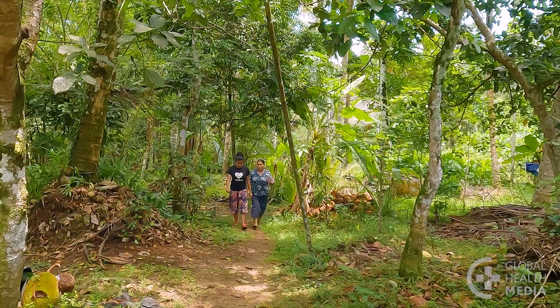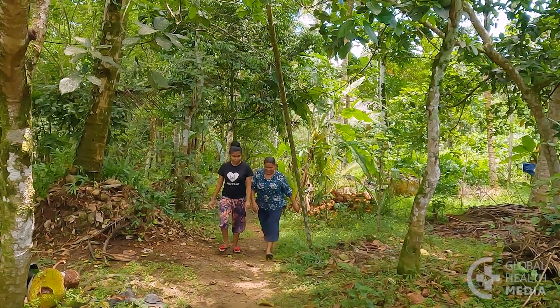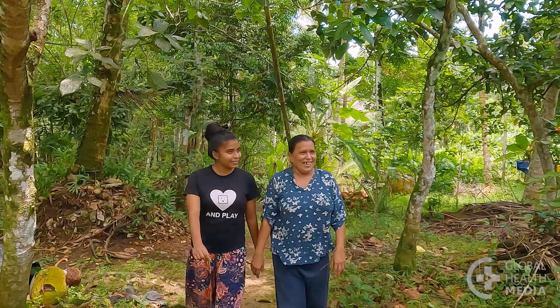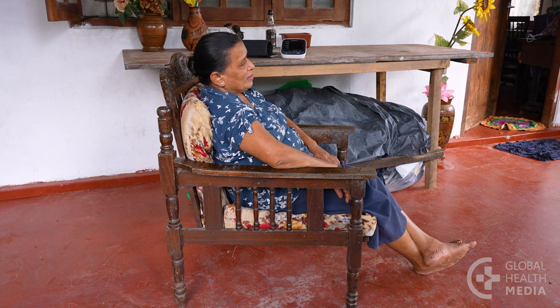To get an accurate reading, avoid eating, drinking, and exercising half an hour before you take your blood pressure. Empty your bladder if needed, then sit and relax for a few minutes.